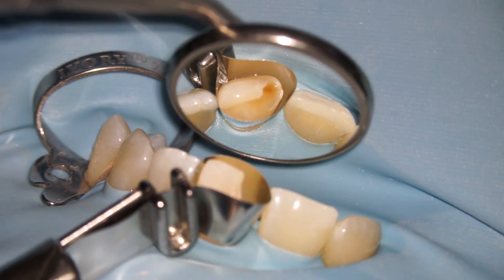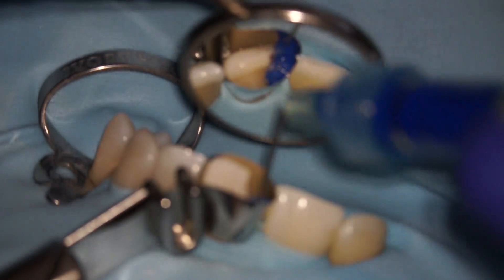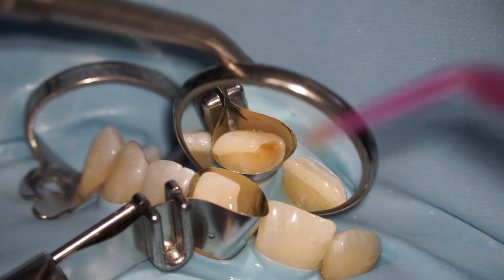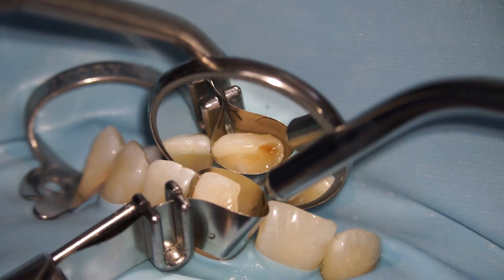You will see an orange spot here — that's just some of the affected tooth structure that's been left behind. Perfectly healthy. Now we're going through the bonding process to make sure that when we do put the filling in, it's going to adhere well to the tooth. We set it with our light to make sure that the bond is nice and ready for the filling we're about to put in.